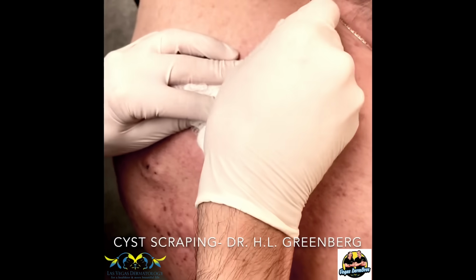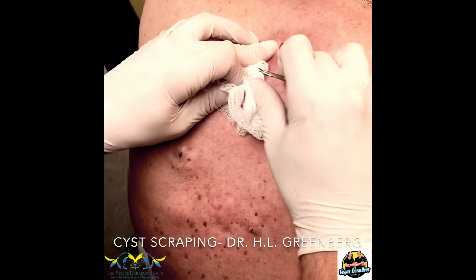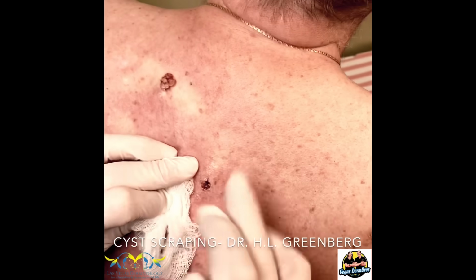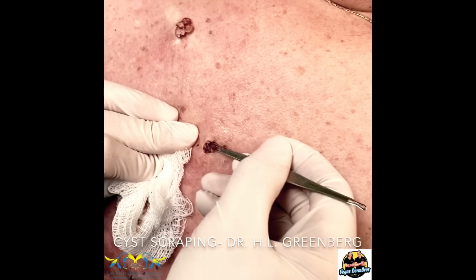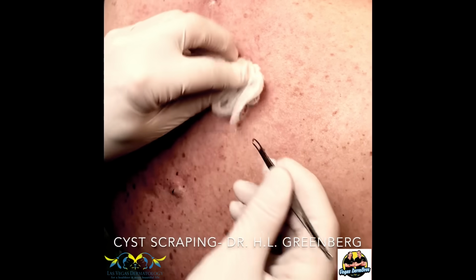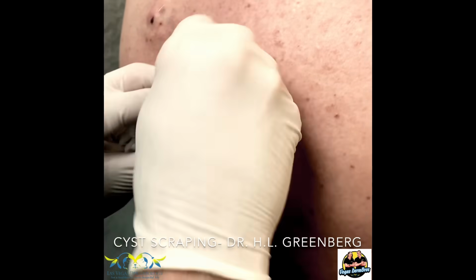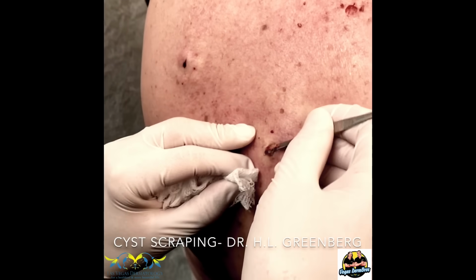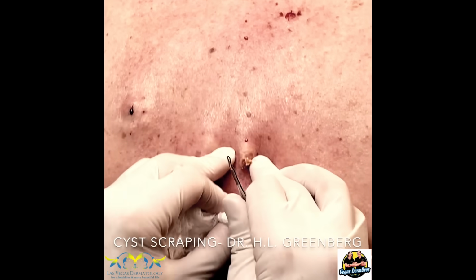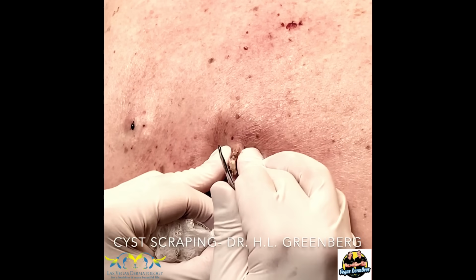And because these have been in there so long, they're really filled up. Oh, my God. Holy crap. So there's one. Dad. Yikes. It's not the worst I've ever seen. Seriously? Yeah. But he does have a bunch. Oh, that was that one that looked like little larva or some crap. That weird one with the hole. That was really weird. Look at that. And it just mushes right out. Nice and easy. It's all keratinized tissue.